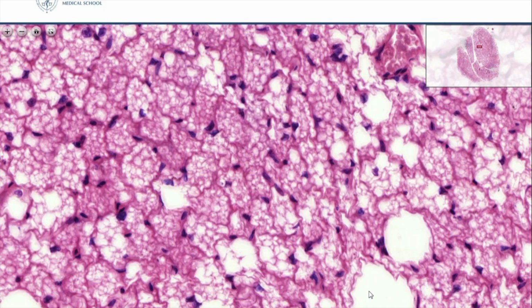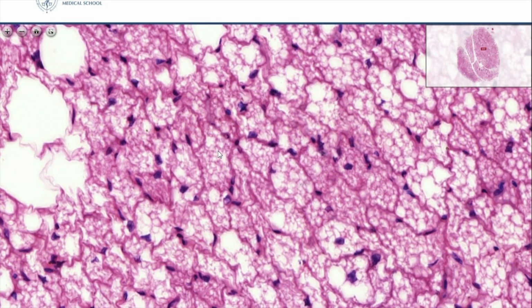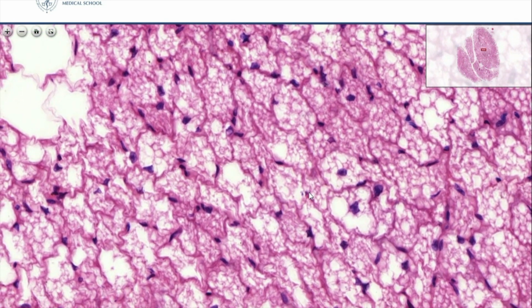They contain one large fat droplet, and this one large fat droplet pushes the nucleus to the side of the cell. And the brown fat cells, they are multilocular fat cells, and they contain a lot of small fat bubbles. Between the fat bubbles, we have also a little cytoplasm that contains a lot of mitochondria. The nucleus is either in the middle or it's pushed to the side, like here for example, or we don't see the nucleus because it's not in the plane of the cut.